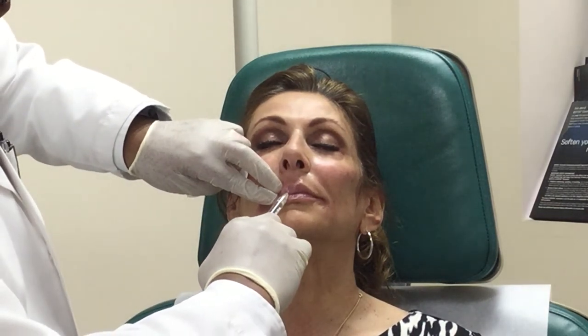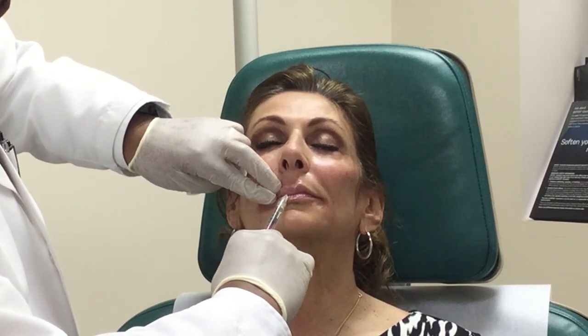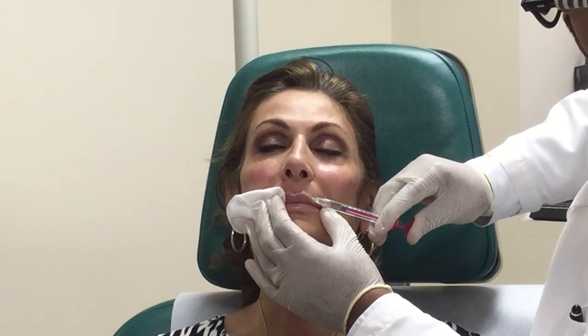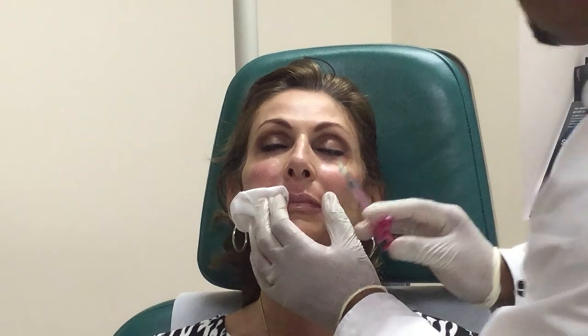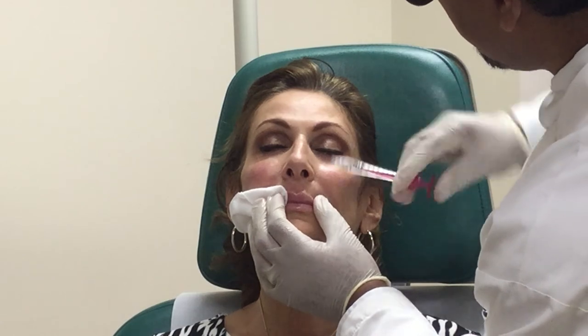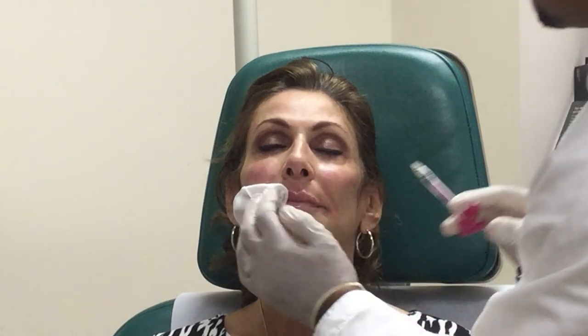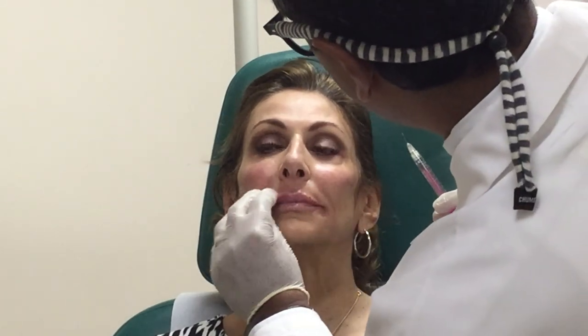Let me get a little of the philtrum column here. Symmetry is important, so I was looking to make sure it's relatively symmetric — you don't want to overdo anything.